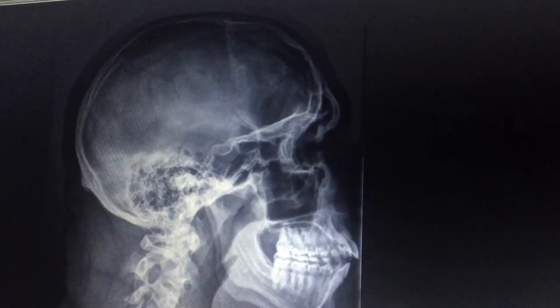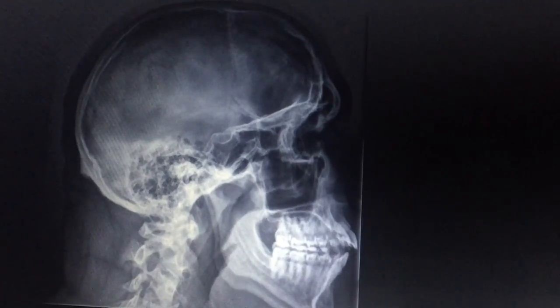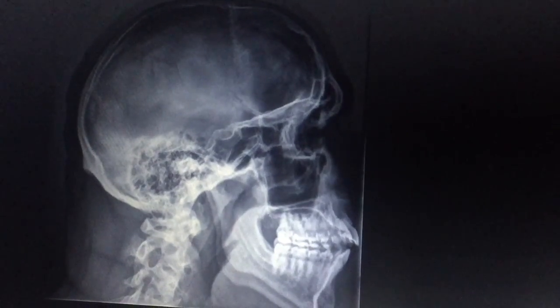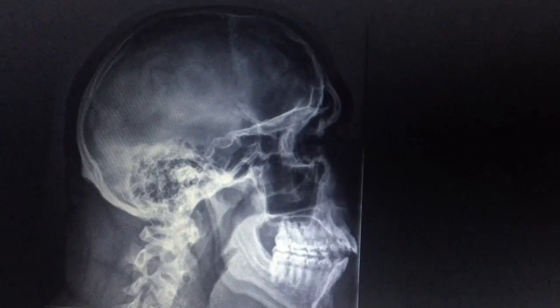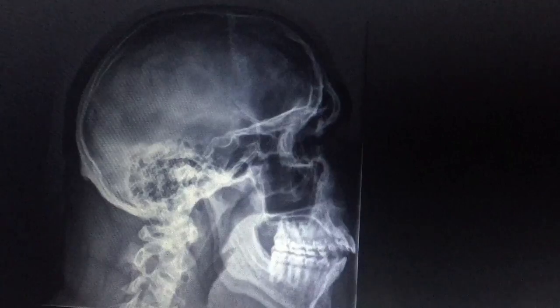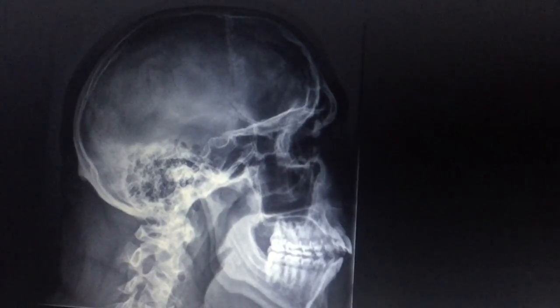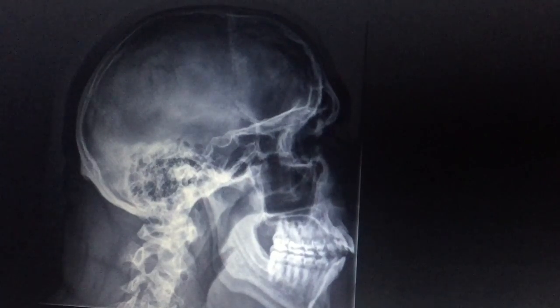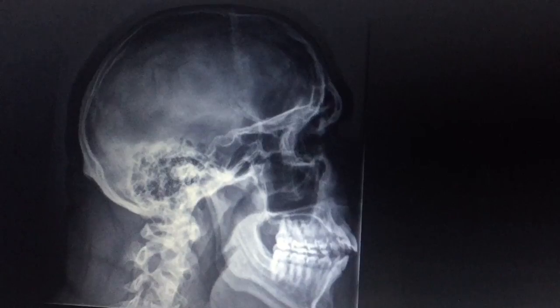After taking my images, I will now evaluate my lateral skull projection. When evaluating my lateral projection, I'm always making sure that there's proper collimation. I want to see the entire cranium without rotation or tilt, and that there are superimposed orbital roofs and greater sphenoid wings seen. Also, the superimposed mastoid regions and EAMs, and that there is superimposition of the TMJs.